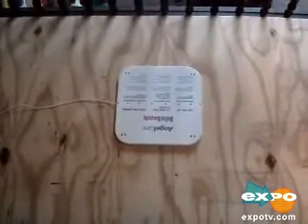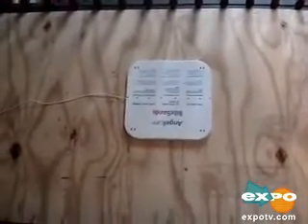Now we have a hard surface to put the baby sensor monitor on. Take the baby sensor monitoring pad and put it directly in the middle of the board, which is also in the middle of the crib. Make sure it's plugged in and that the cord is out of the baby's reach. Next, place the baby's mattress over the sensor, and that is all you have to do to set it up.